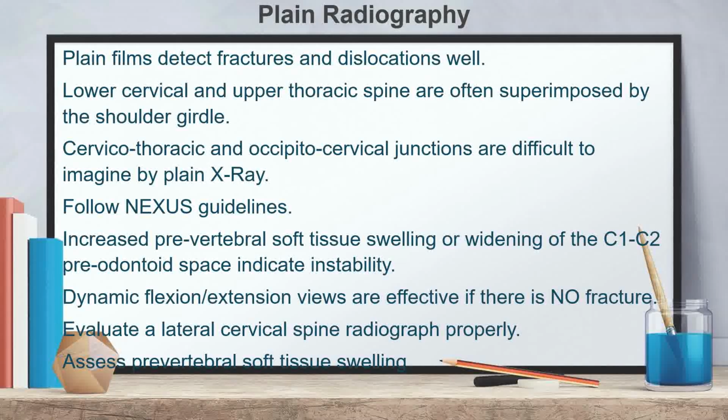They can help assess spinal stability in the longer term but should not be undertaken acutely because of the challenges associated with visualizing the cervicothoracic junction. Plain radiography and initial cervical spine CT scan is now often obtained in the acute setting.